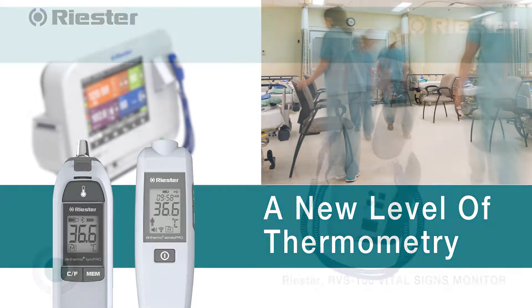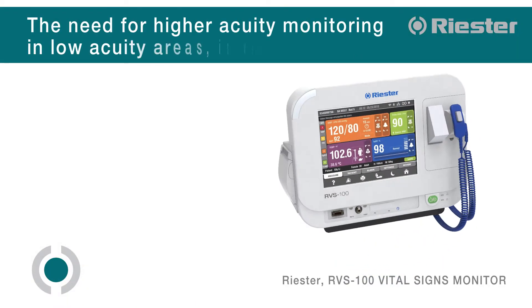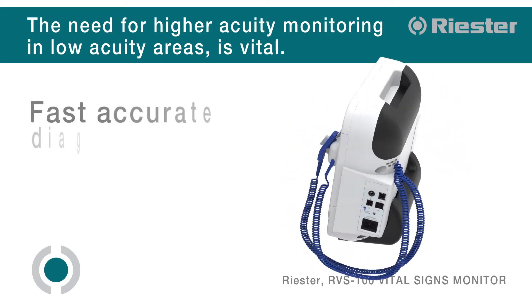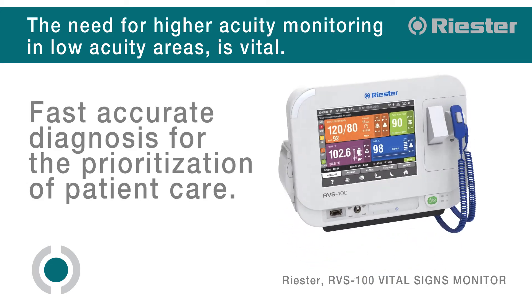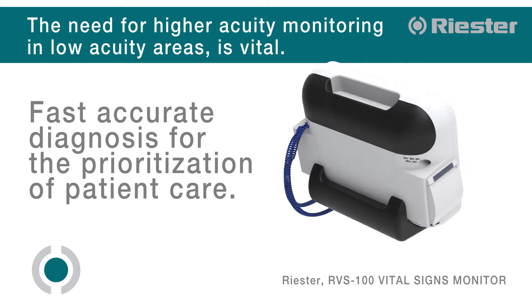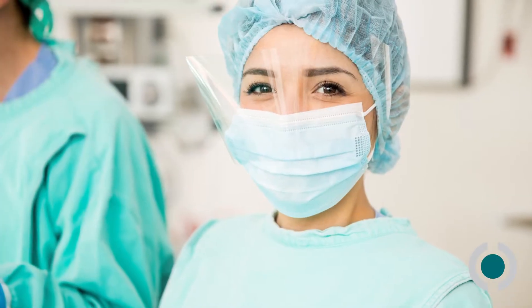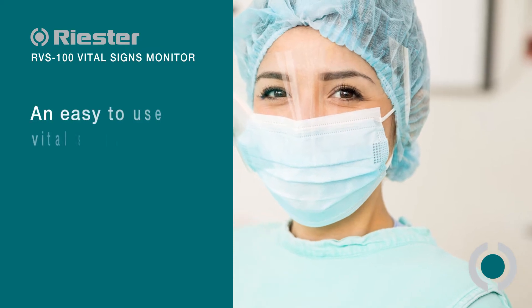The need for higher acuity monitoring in low acuity areas, where fast, accurate diagnosis for the prioritization of patient care is vital in modern healthcare systems today. The Riester RVS100 is an easy-to-use vital signs monitor with pulse oximetry.